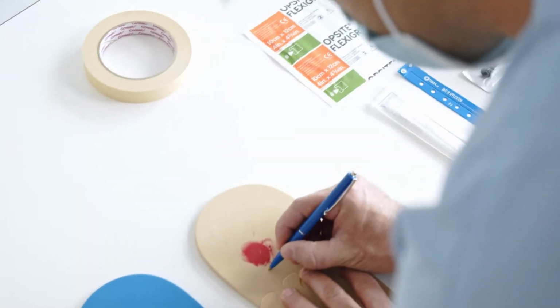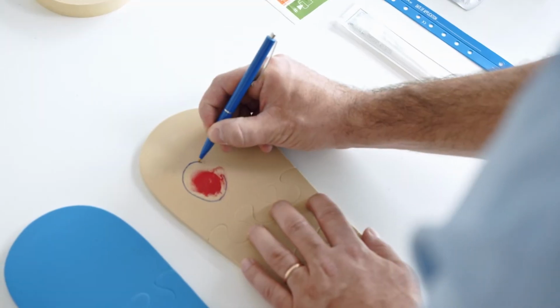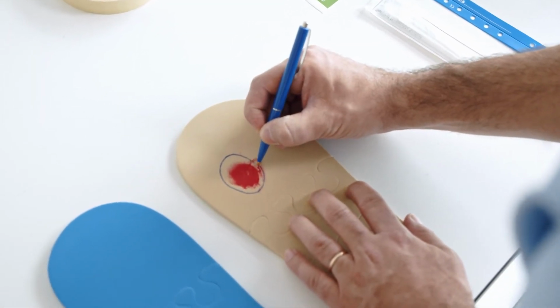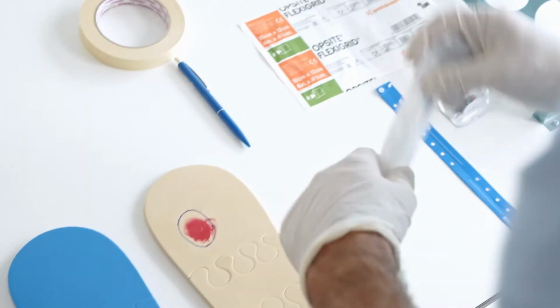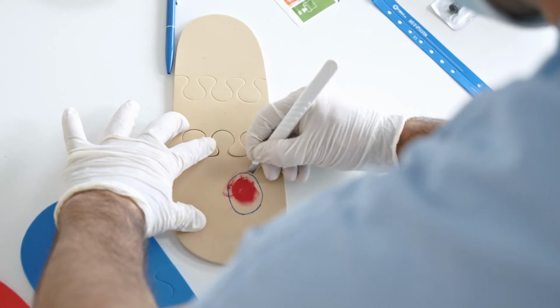We mark the perimeter of the impression with a pen, adding a margin from about 5 mm up to about 10 mm in the distal area. To remove this part, we use a scalpel, placing the blade at around 45 degrees.